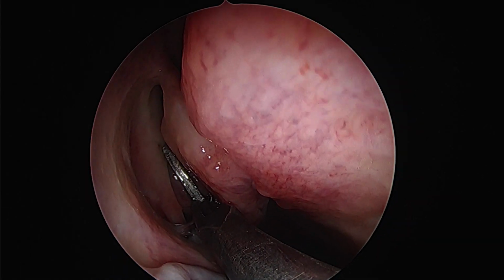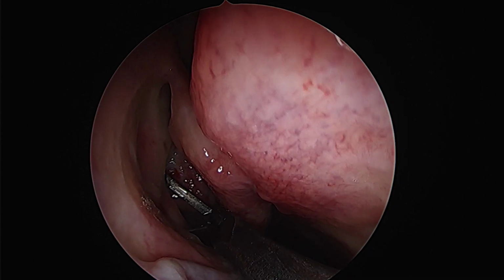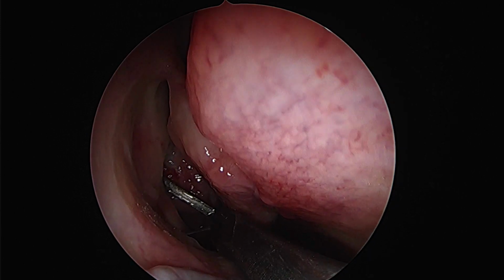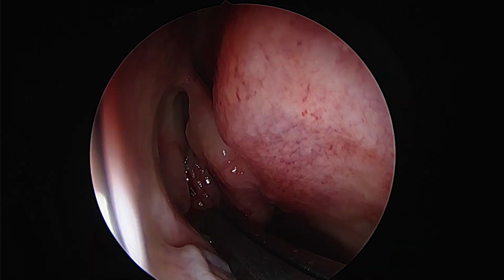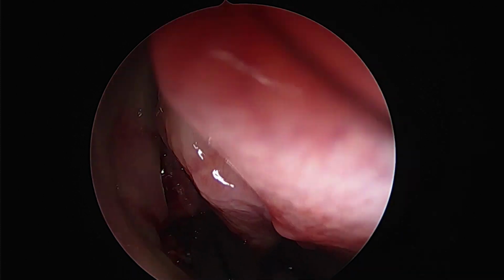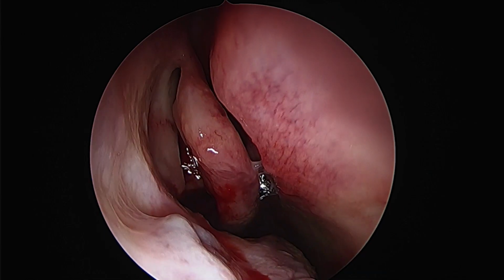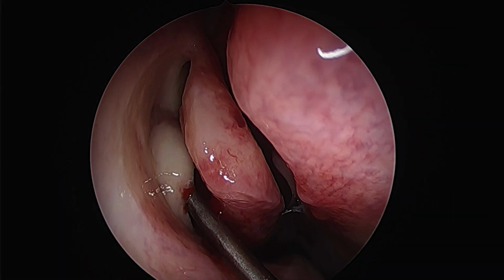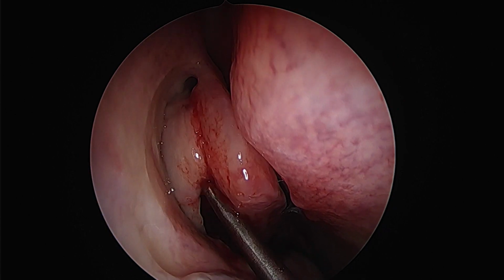This is a video demonstrating the surgical repair of a meningocele and CSF leak on the right side of the nasal cavity stemming from the cribriform plate. We'll begin the surgery by doing a basic sinus exposure, initiating uncinectomy and a wide maxillary antrostomy.